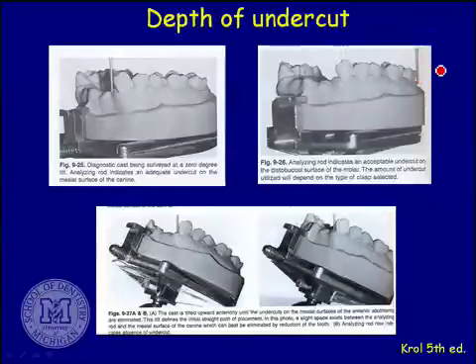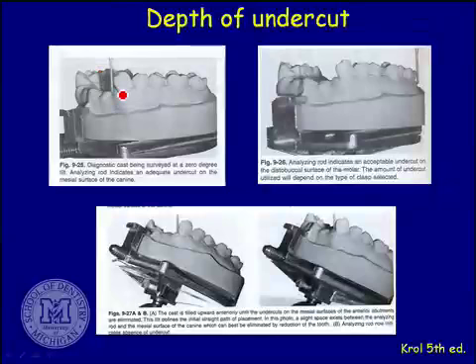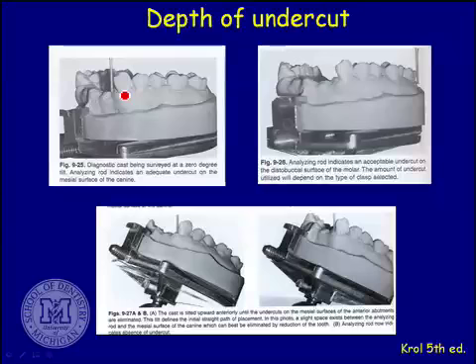And then when you tilt the cast so that you're looking for your secondary path of insertion, you tilt the cast posteriorly till your survey shows that you've got no undercut here. So if that's my secondary path of insertion and that's my primary path of insertion, the total amount of undercut I have available to use is the difference between the two surveys. So in this particular case they used as illustration, I can pretty much work out a survey that will let me use the entire proximal of that as my undercut on my rotational path. So it's the difference in the undercut between the two paths of insertion that you pick up.